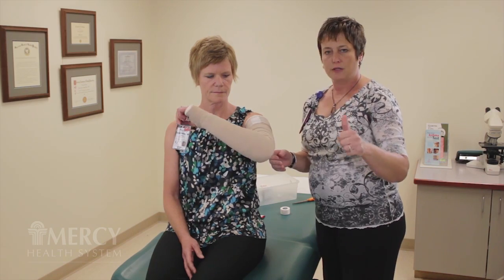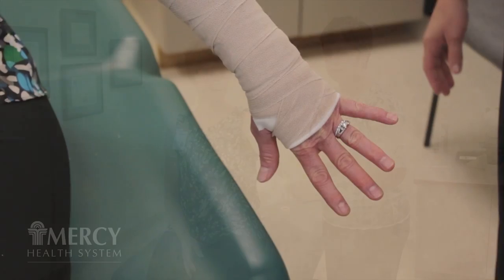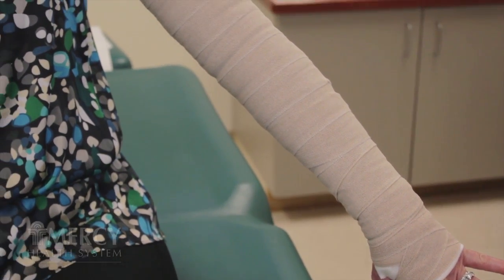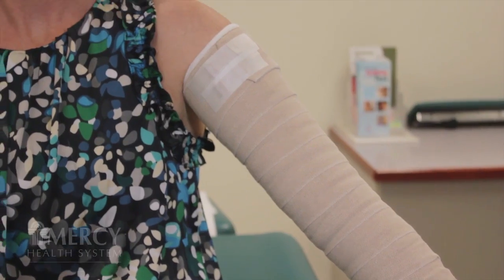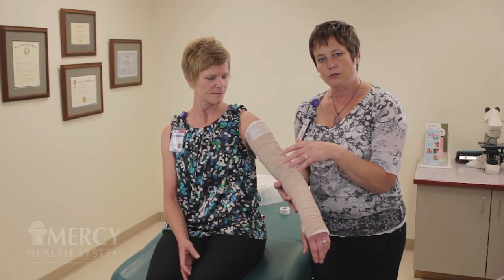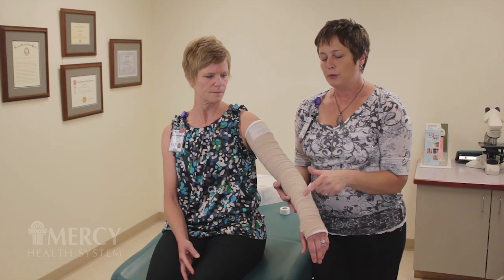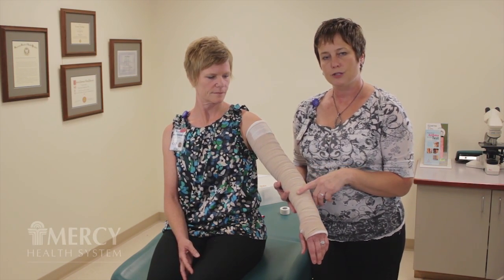It's always a good idea to move around a little bit once you get that wrapped — it's going to feel a little bit restrictive, but you should still be able to do your normal activities with it on. If you're going through your day and it starts to feel too tight because of your activity, you may take off that third bandage layer, leaving you with layers one and two. After a couple of hours, however, I would put that third bandage layer back on so that you get the best possible compression from your bandages.